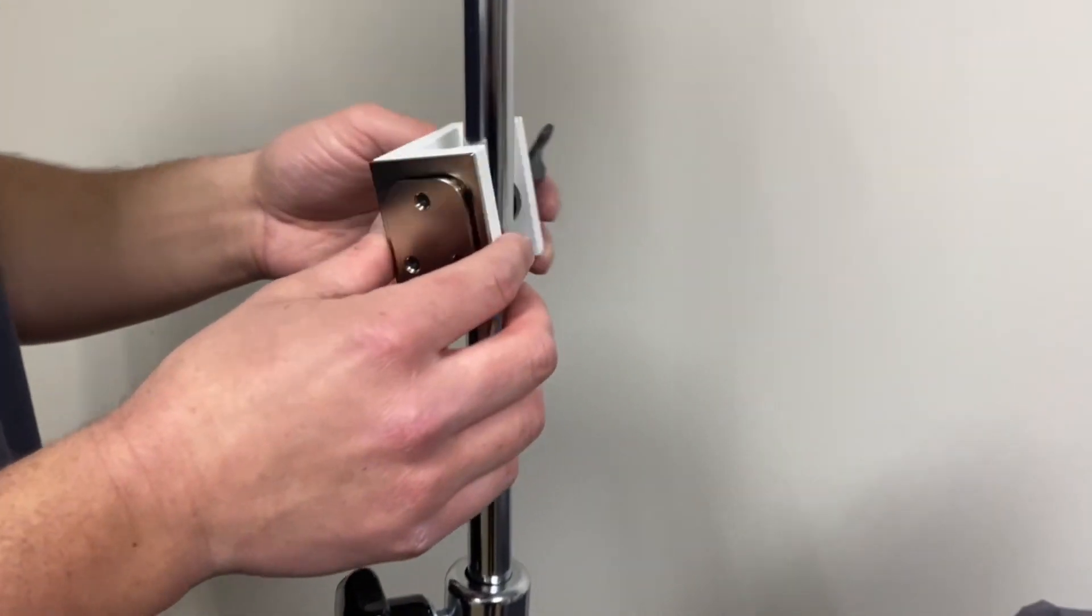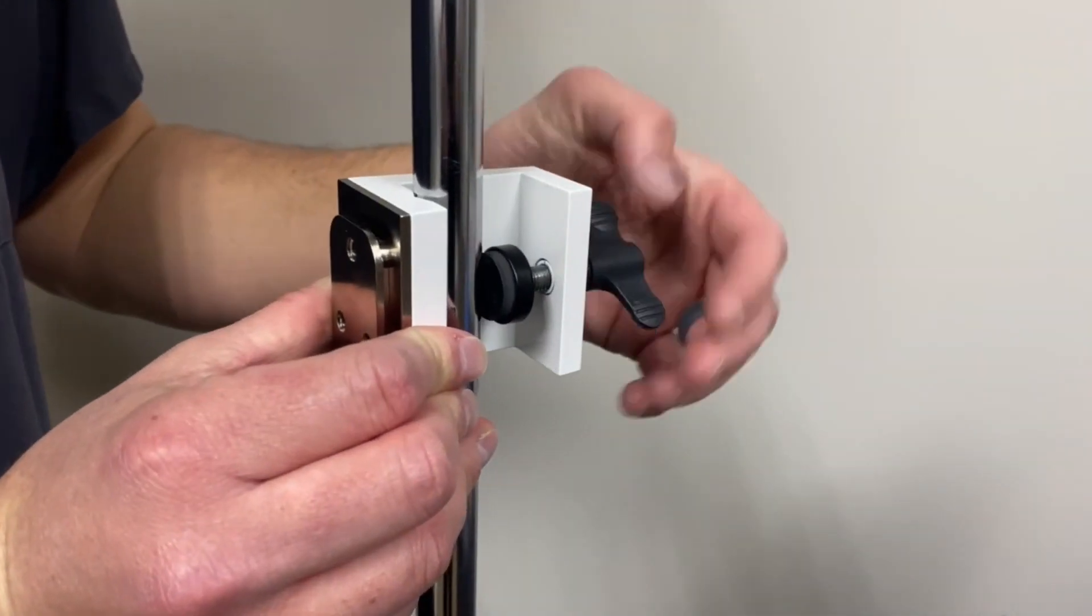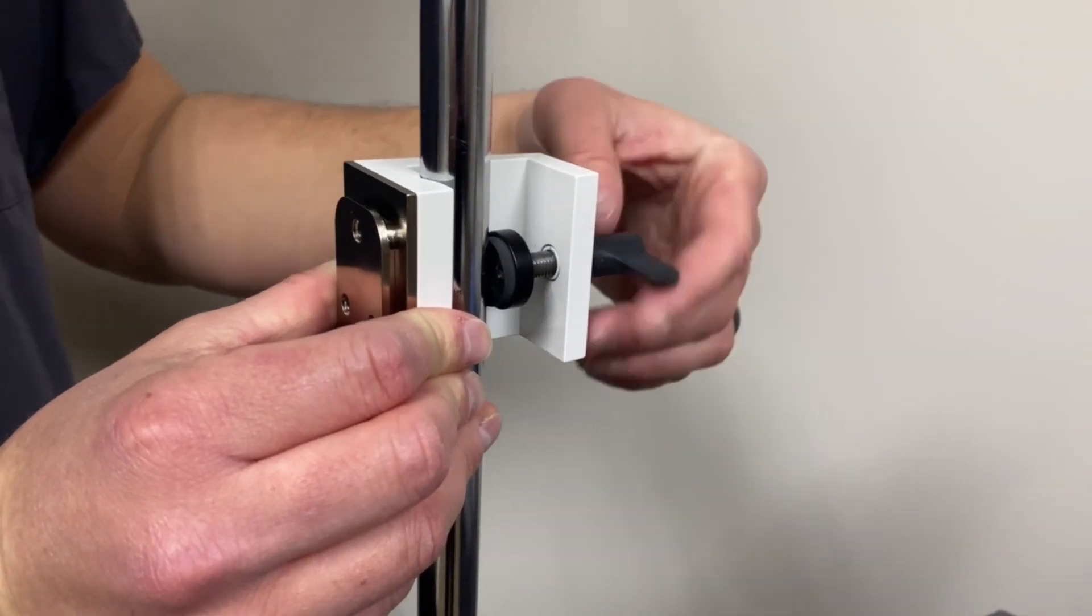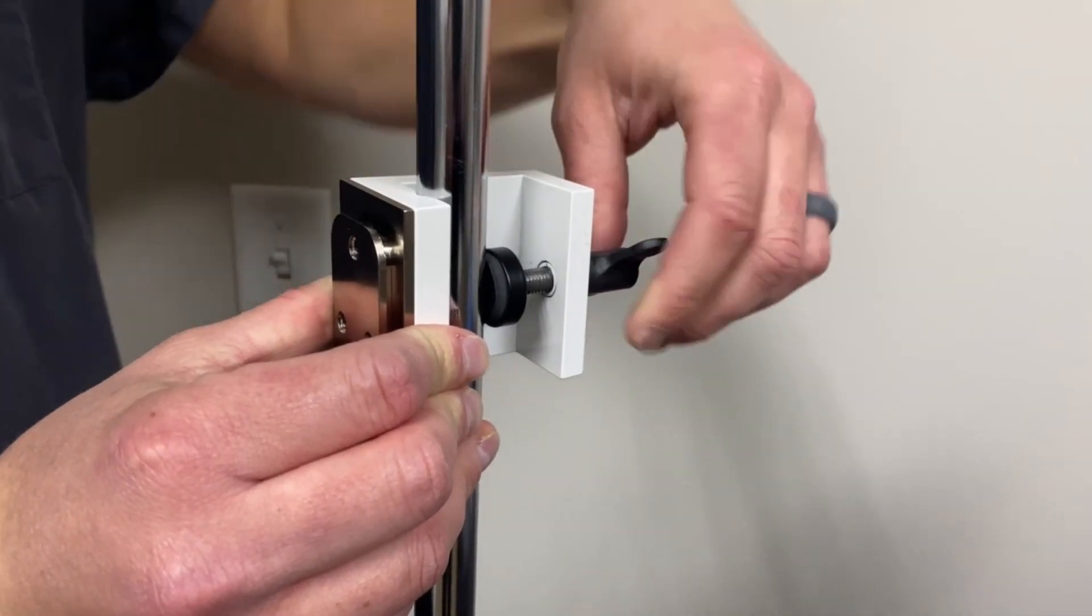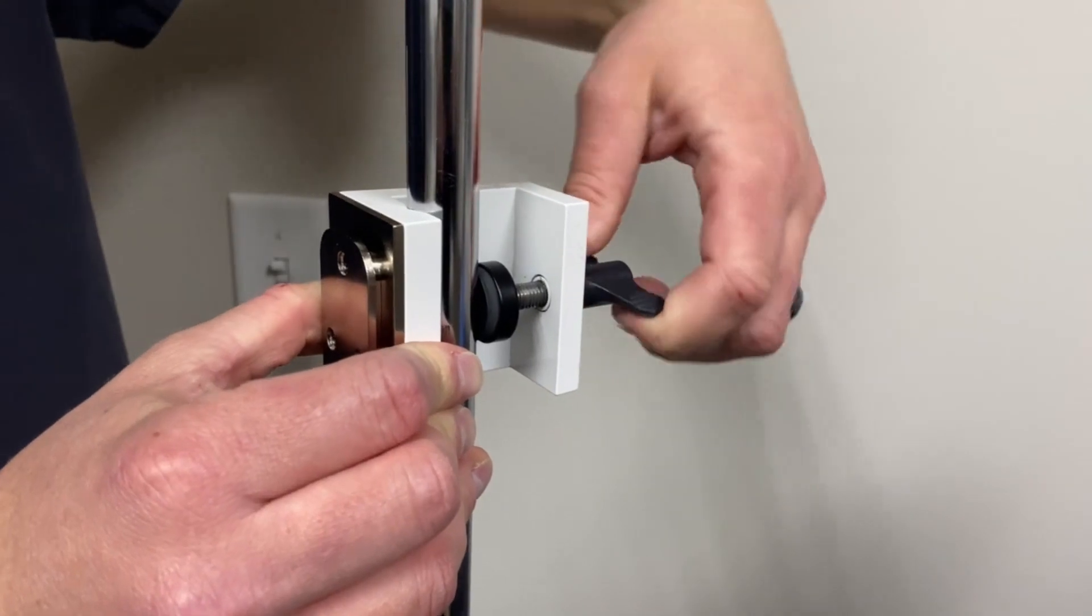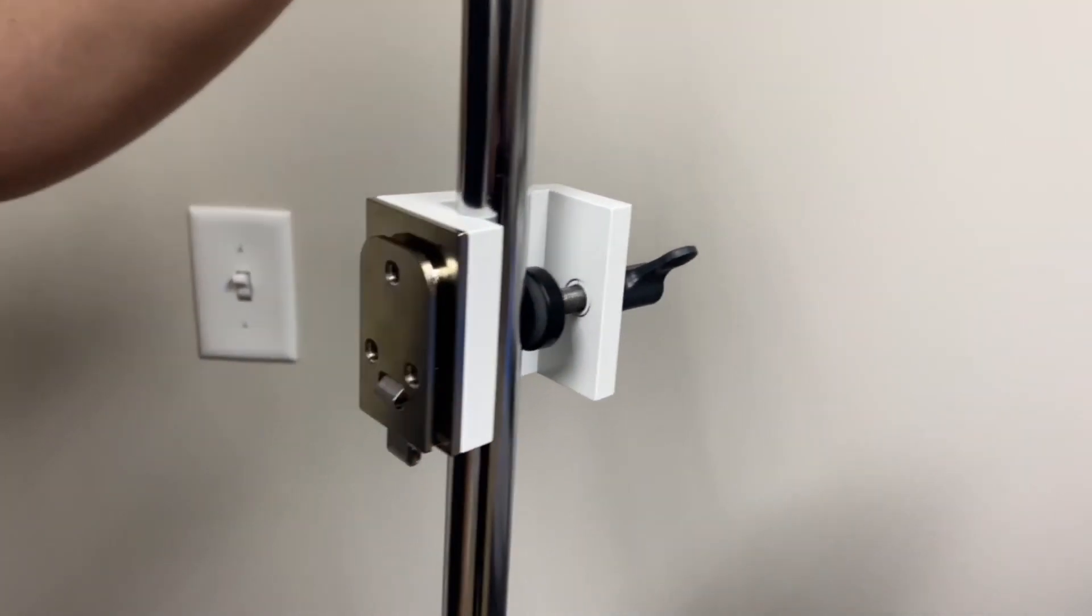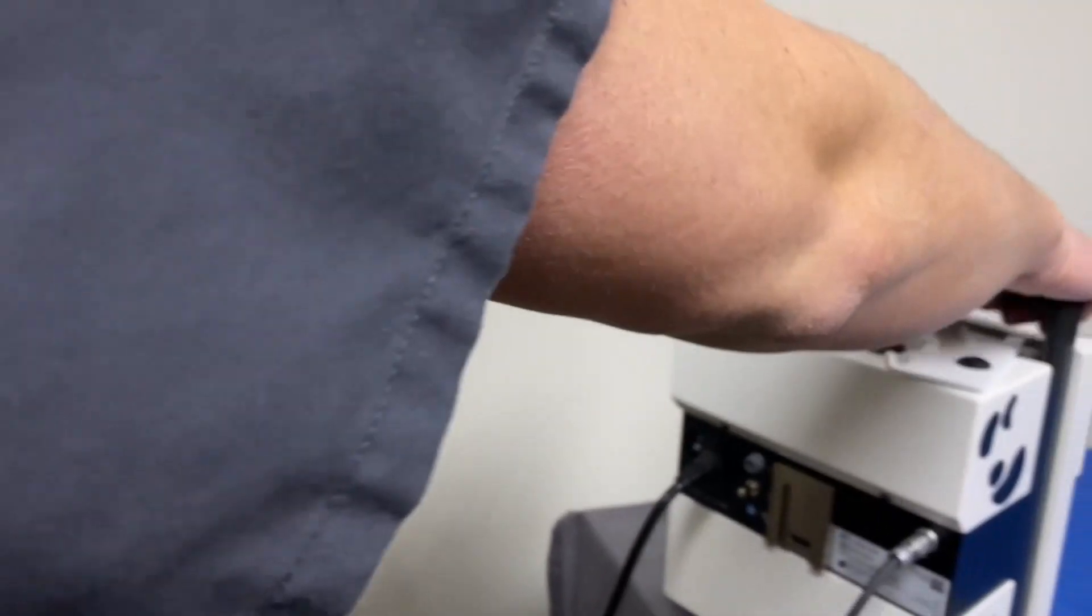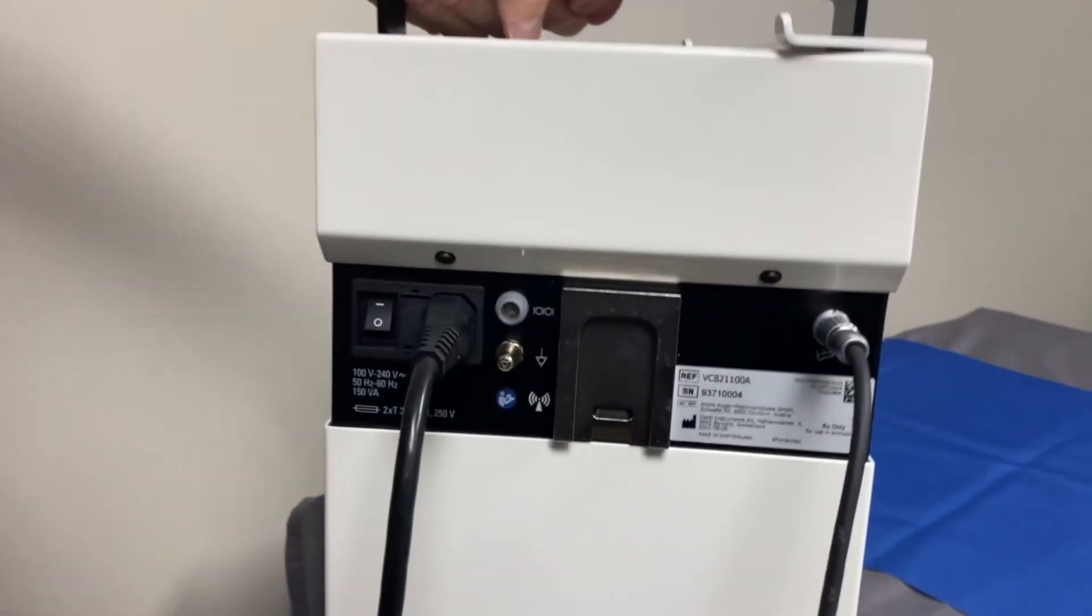To set up the device, you can either place the Alaxos 3 onto an IV pole or onto a counter next to the surgical table. If you're attaching it to an IV pole, fasten the locking mechanism onto the IV pole. Ensure that it is screwed tightly into place. Place the machine onto the locking mechanism, ensuring that it locks into place. You'll hear a click.